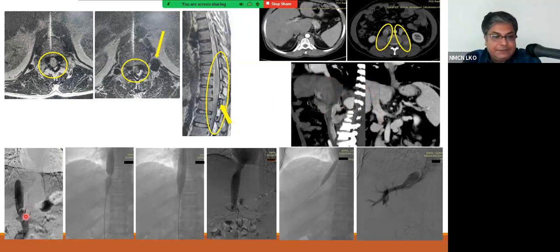On venography, performed from the transfemoral route, we see a complete, smooth obstruction at the level of upper hepatic IVC. This was gradually navigated with the guide wire and catheter, and over the wire, a balloon was placed across the occluded, stenotic segment. Balloon dilatation was done, and post-angioplasty, we can see excellent restoration of antegrade flow from IVC to heart with disappearance of the collateral channels.